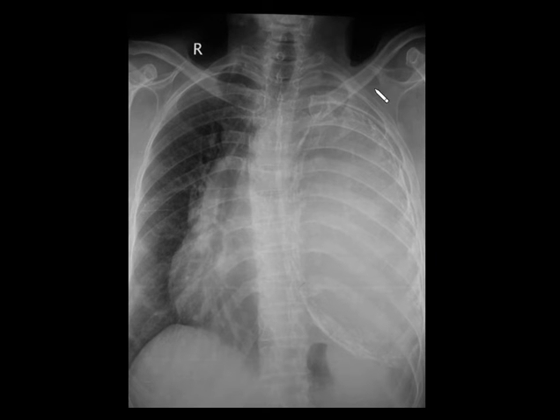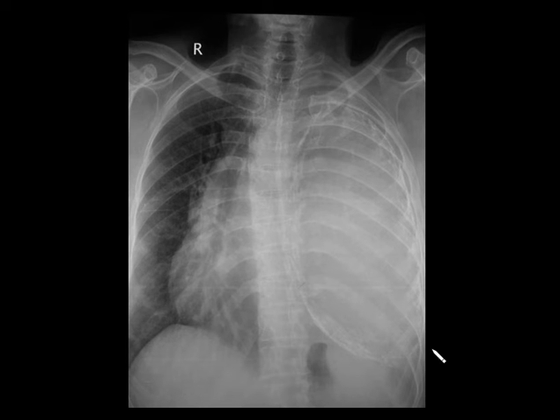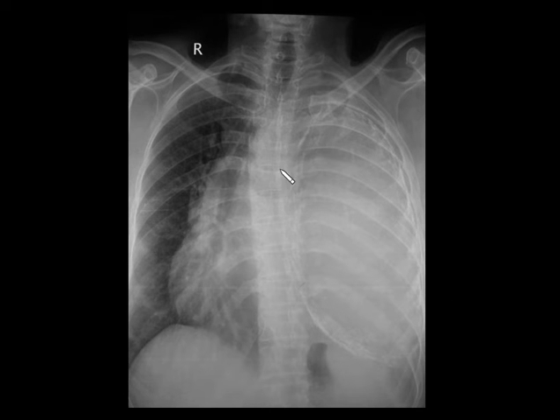Coming to the next spotter, you can see a radiopaque density overlapping the left hemithorax, broad-based towards the pleura with eccentric rim calcification and causing significant mass effect and mediastinal shift. This is a chronic calcified empyema, classically seen in tuberculosis. Another differential to consider is a calcified pleural mass.